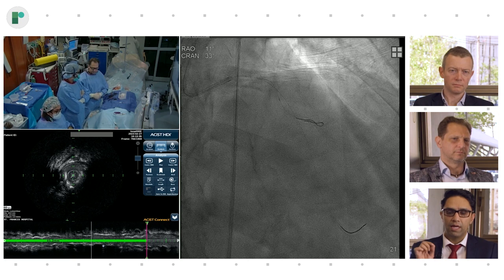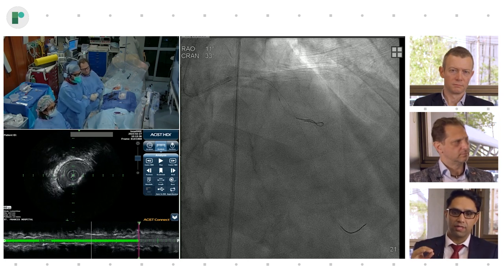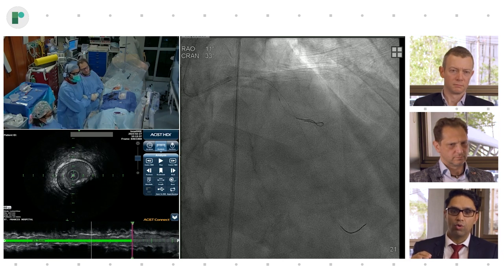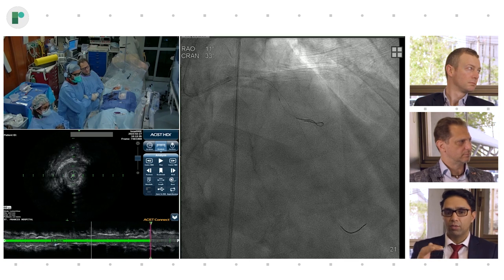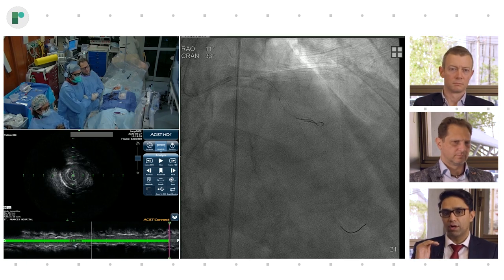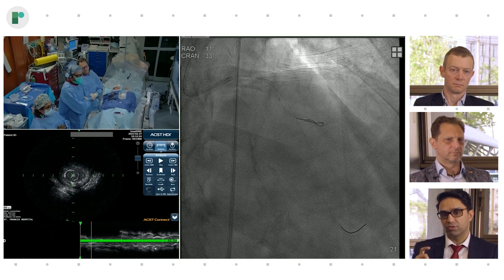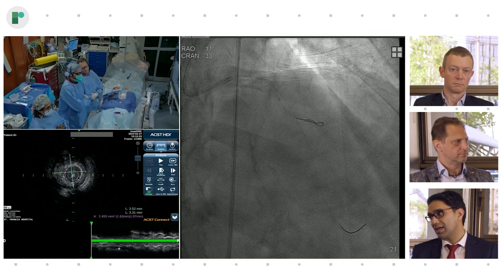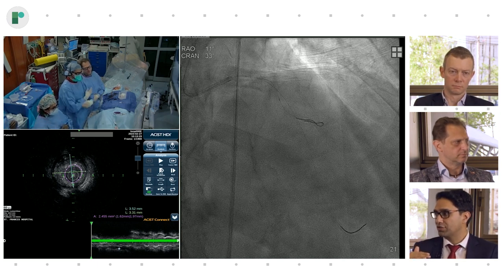So when you have a very, very tight lesion, the distal vessel is actually underfilled. And so when we're sizing this, we're actually undersizing somewhat. We know that when you put a stent into a lesion, in 40% of cases the vessel grows by at least one device size. And the tighter the lesion, the more likely that is to happen because of this decompression.